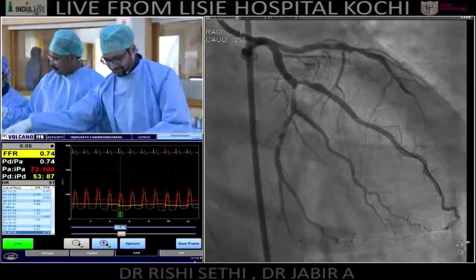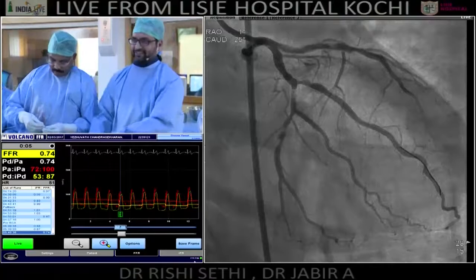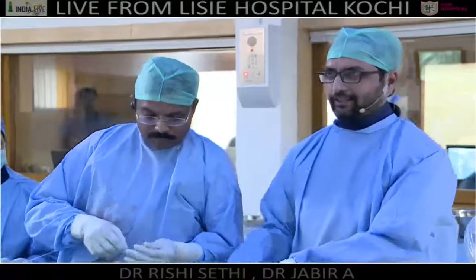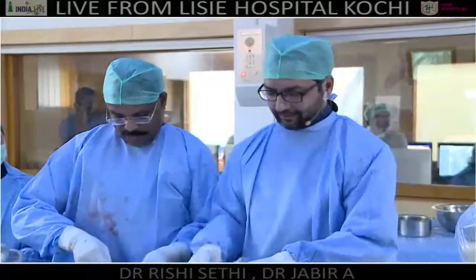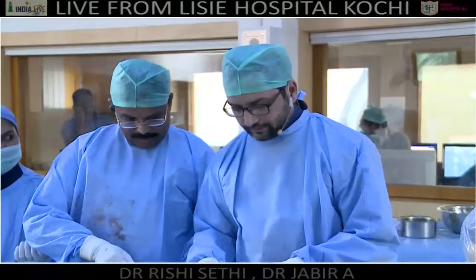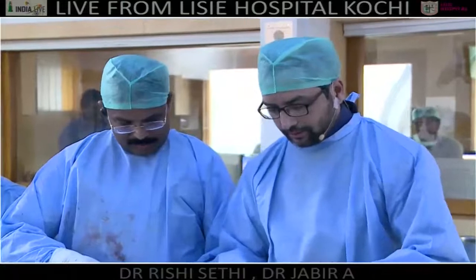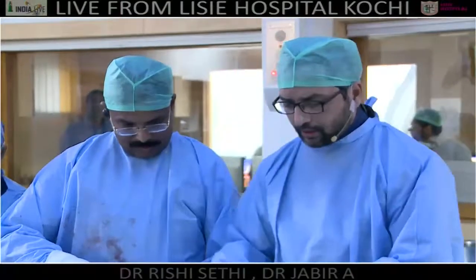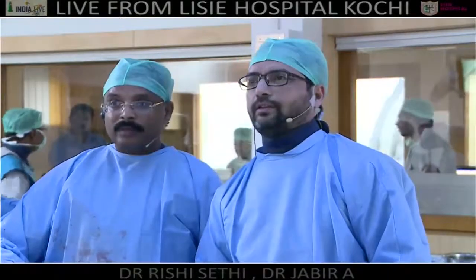Rishi, Dr. Palajani here. You've got three OMs there, sir. Right? OM1, OM2, and OM3. Amongst all these three, the largest branch, if anybody would like to dilate, is the first one. If that is not significant by ischemia testing, I think it goes without saying the patient goes for a medical line of treatment. I think it should be a deferred stenting. What is the event rate if we treat this patient on a medical line of treatment? If you showed ischemia on the FFR or IFR, I think then you are justified in doing that. But otherwise, the rest of the two OMs look like very low risk lesions and low risk vessels, I should say.